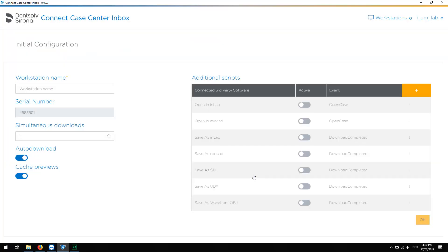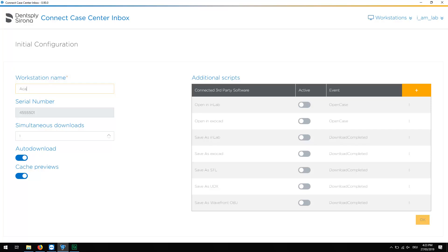To begin with, create a unique name for the workstation where you have installed the inbox. In our case, this is Academy1. The serial number is assigned automatically. It is grayed out and therefore can't be edited.